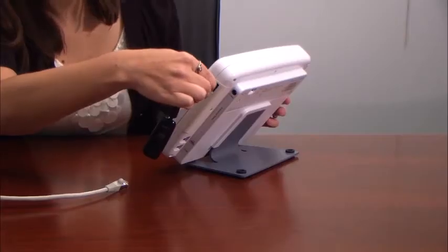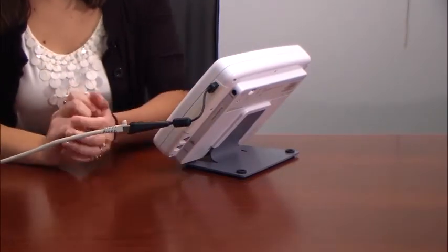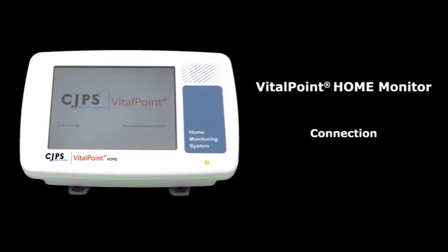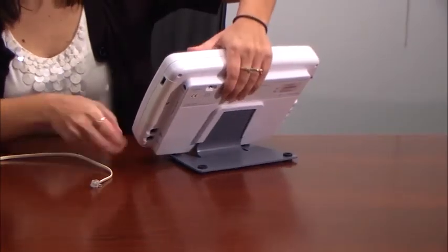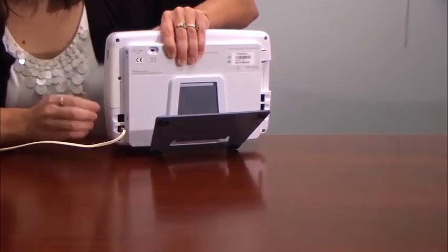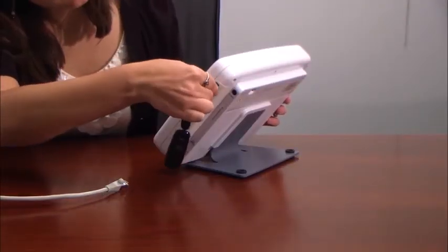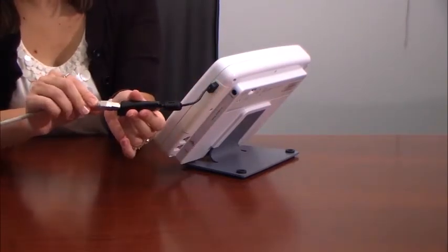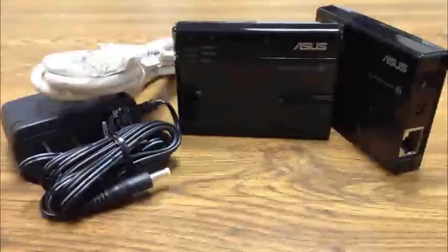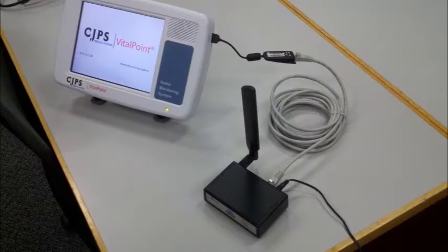The monitor boasts very high compliance due to its user-friendliness and its ability to connect from anywhere with ease. The four ways in which the VitalPoint can send data to the HIPAA-compliant servers are: 1. Through a regular analog phone line, using the provided telephone cable. 2. Through the Internet, using an Ethernet adapter. 3. Through the Internet, using a Wi-Fi secure bridge. And 4. Through a cellular modem.